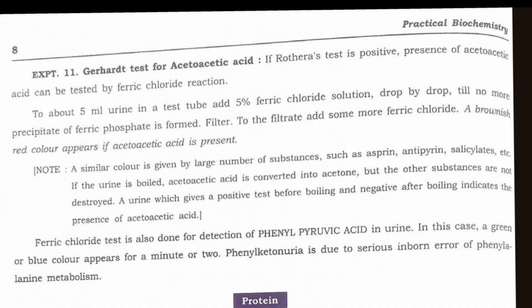To the filtrate add some more ferric chloride. A brownish red color appears if acetoacetic acid is present.